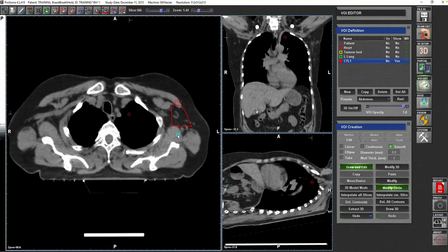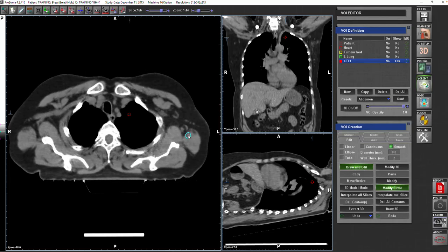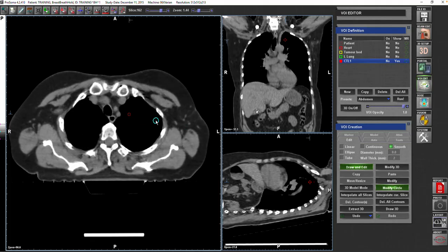What I'm trying to do now is to sensitize you to what you read in the table. You need to read the table of the guidelines. I'm not here to give you the table or to read the guidelines for you, because it's easy for you to read the guidelines, get the CT atlases, and look at them. I'm trying to make your mind a bit systematic in terms of what you have to look at and what to search for. This is the most important thing.